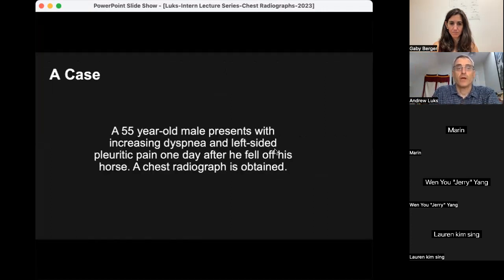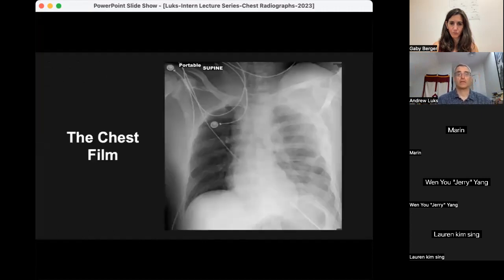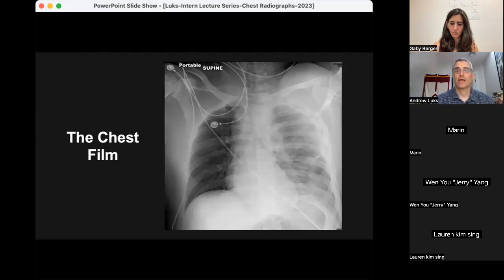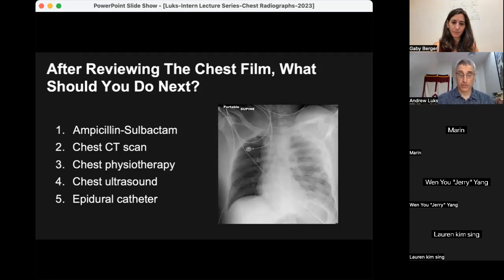Finally, our last case: a 55-year-old male with increasing dyspnea and left-sided pleuritic pain one day after falling off a horse, who presents to the emergency department where a chest radiograph is obtained. After reviewing this film — done with the patient in a supine position — the appearance is pretty suggestive of a pleural effusion, which following trauma is most likely a hemothorax. The easiest way to confirm fluid in the chest would be chest ultrasound, which would confirm this patient warrants a chest tube.